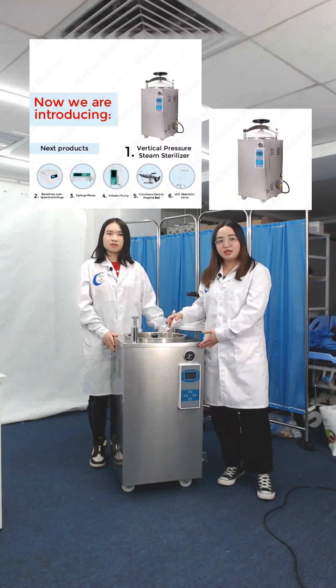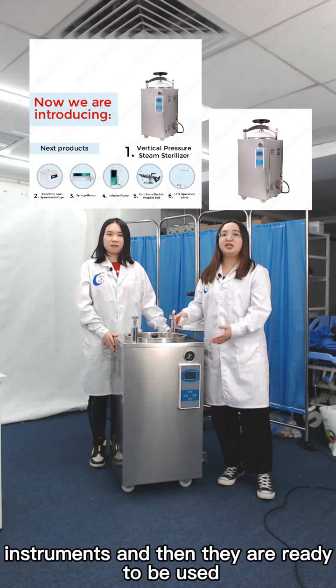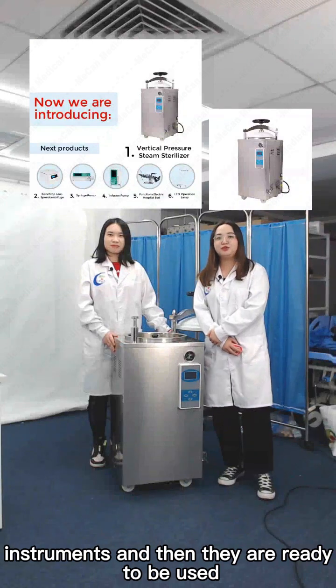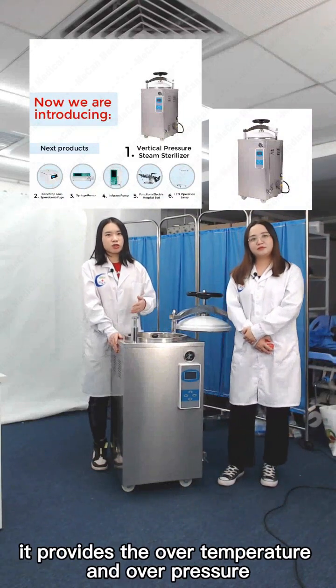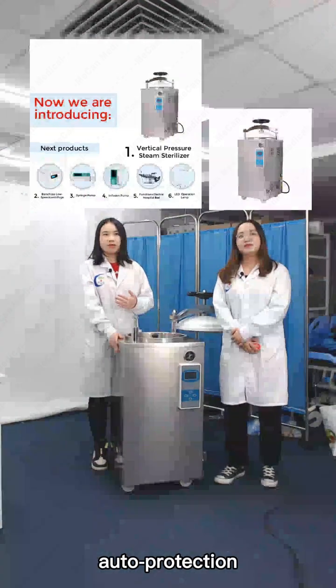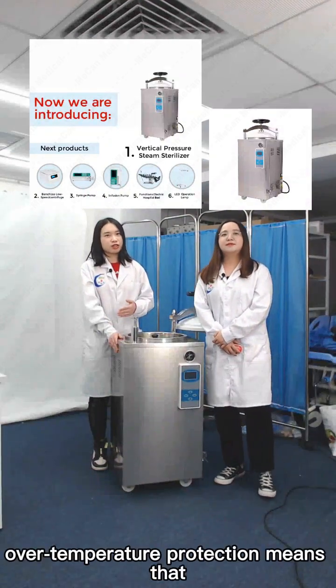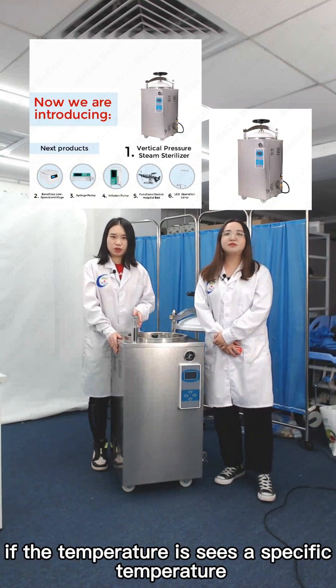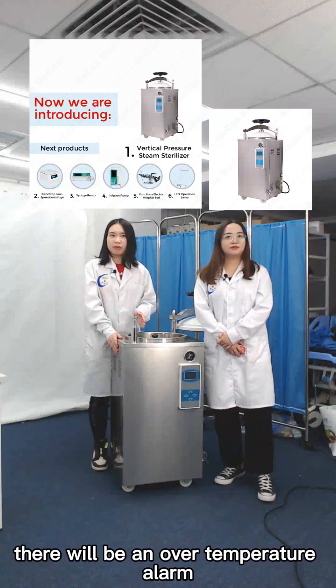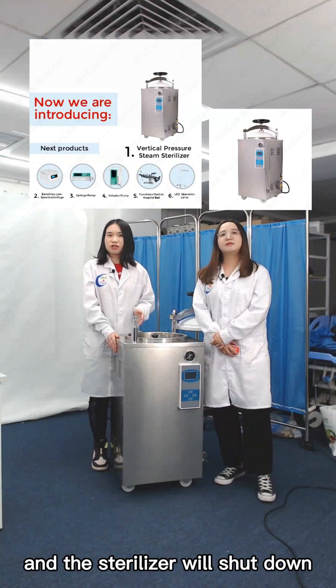Once sterilization is finished, we can pack the instruments and they are ready to be used. Besides, it provides over-temperature and over-pressure auto-protection. Over-temperature protection means that if the temperature exceeds a specific value, there will be an over-temperature alert and the sterilizer will shut down.